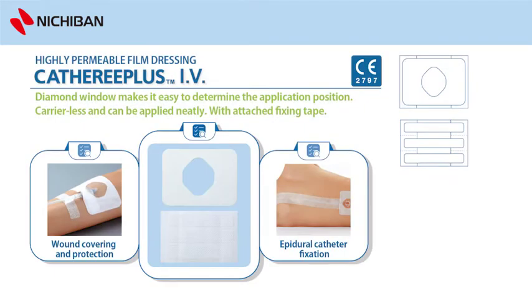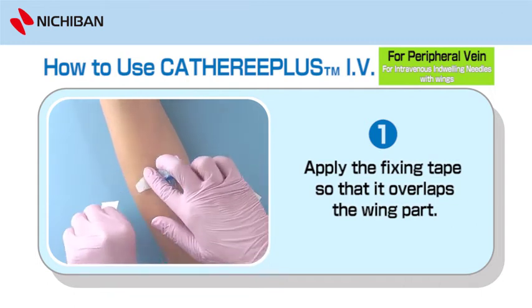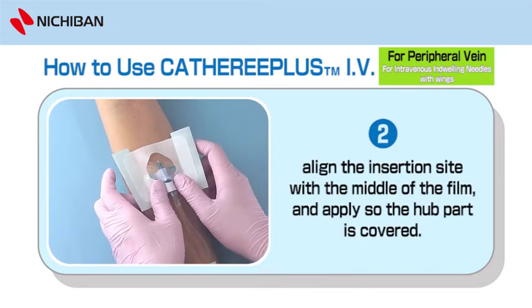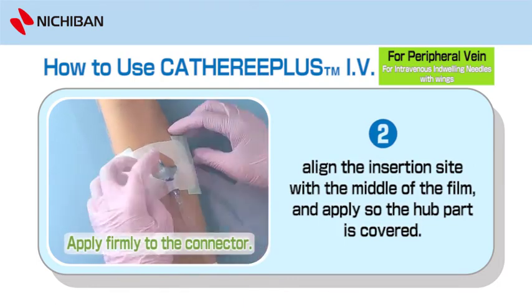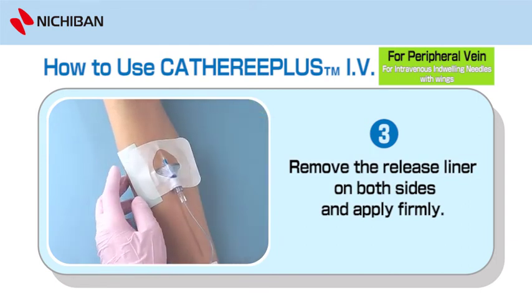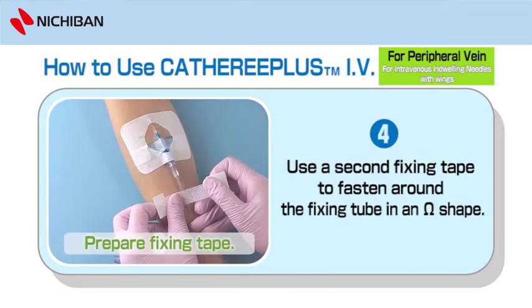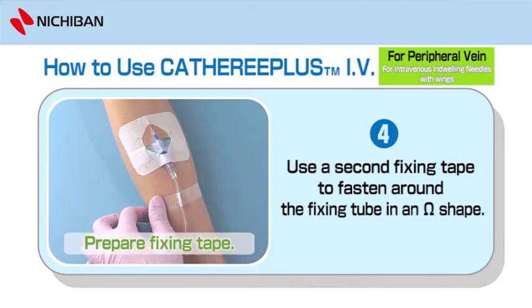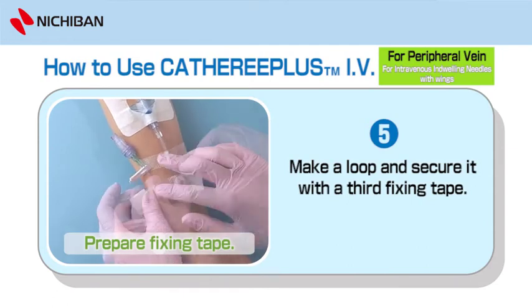Use Cathereeplus I.V. for intravenous indwelling needles with wings. Apply the fixing tape so that it overlaps the wing part. Slowly remove the central release liner, align the insertion site with the middle of the film. Apply so the hub part is covered. Apply firmly to the connector. Remove the release liner on both sides and apply firmly. Use a second fixing tape to fasten around the fixing tube in an omega shape. Make a loop and secure it with a third fixing tape.